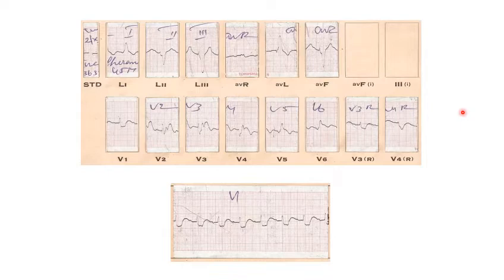Sir, this ECG shows wide QRS complex. Very good. Sir, it is of left bundle branch block morphology. Very good. Sir, axis is left axis. Okay. And sir, in a left bundle branch block pattern, if there is left axis deviation, what does it mean? Sir, LVH. Yes, very good. People have thought that it is one of the indicators of LVH in presence of left bundle branch block. Another indicator of LVH?